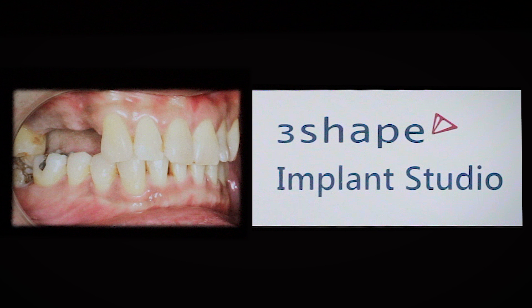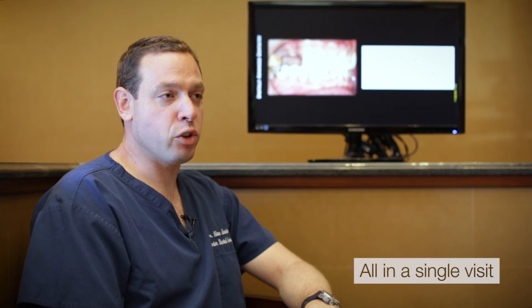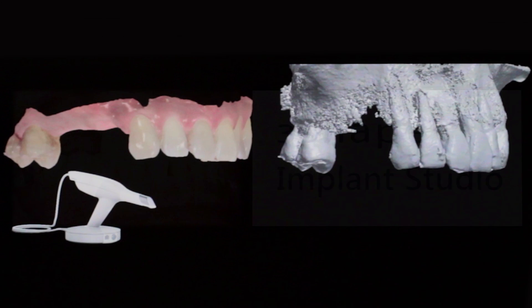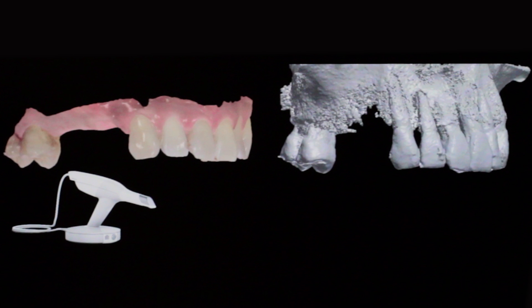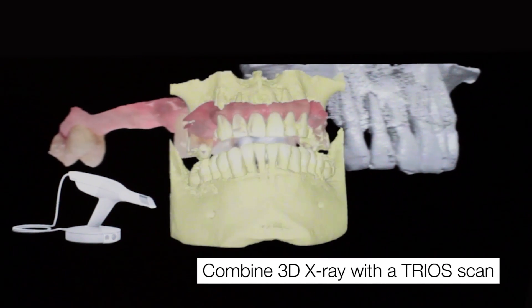One of our favorite cases using Implant Studio was a case where we were able to provide our patient a very predictable, safe, and efficient form of implant treatment, all done the same day. We were able to take the patient's preoperative scan as well as the patient's 3D X-ray and very efficiently combine that together within Implant Studio.